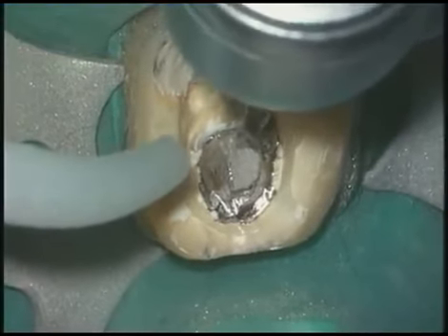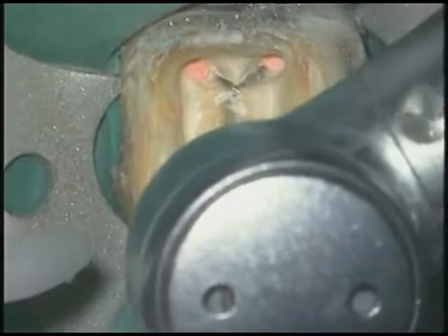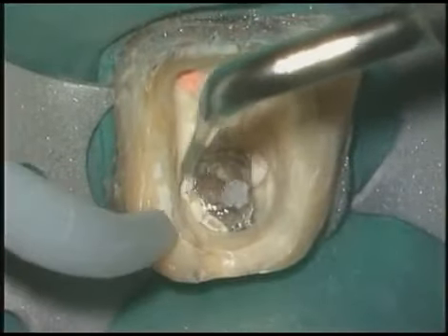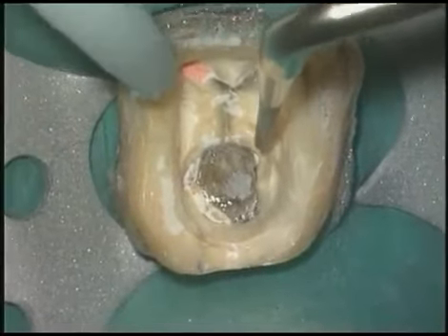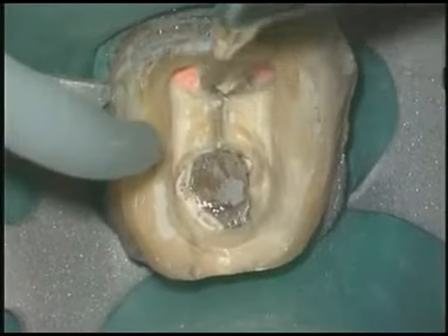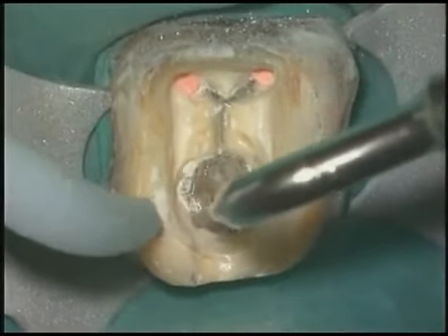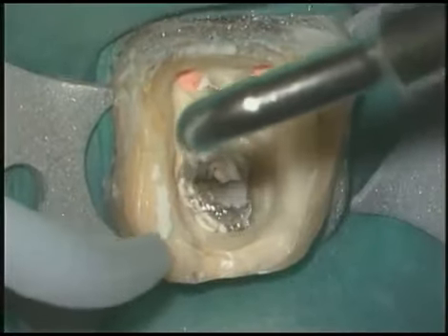At times, I remove the clinical crown to dramatically improve vision during my retreatment exercises. The cast core must be reduced to facilitate post removal. A parallel-walled Pro Ultra number 4 can be used circumferential to the post to vibrate and break up cement. Use this instrument at the lowest power that will accomplish the clinical task. This instrument is carried lightly around the post. A brushing action breaks up cement.